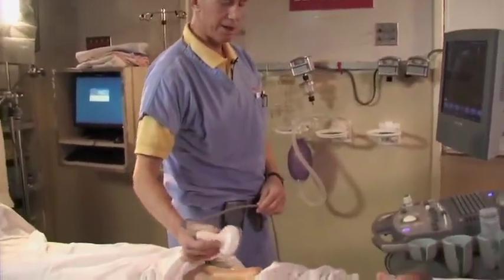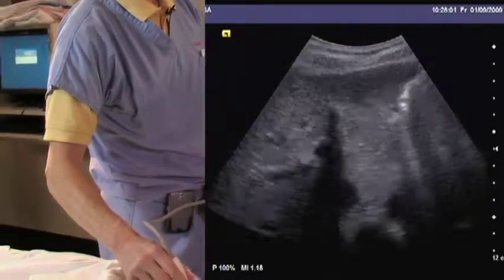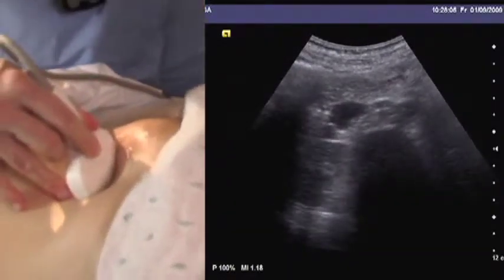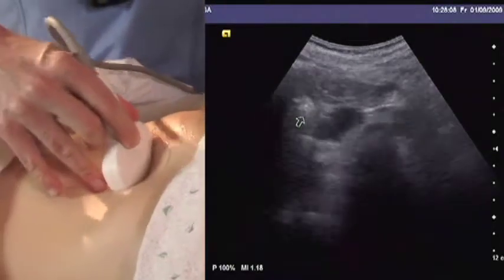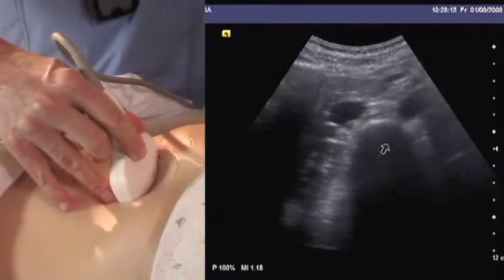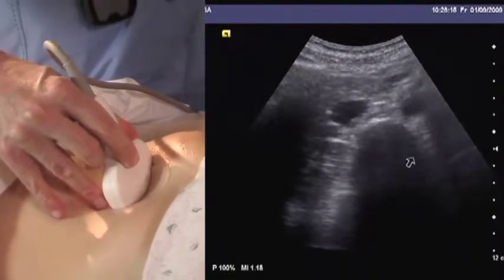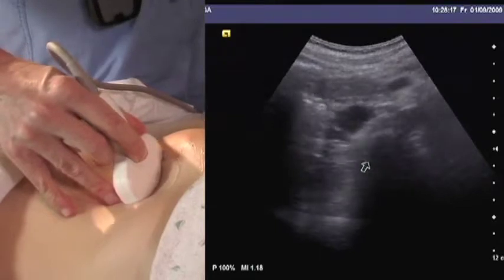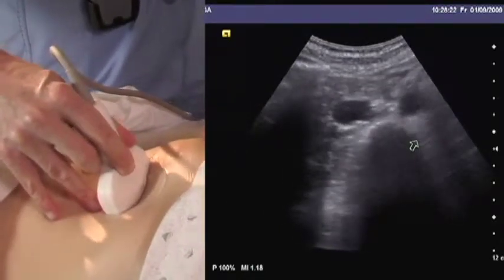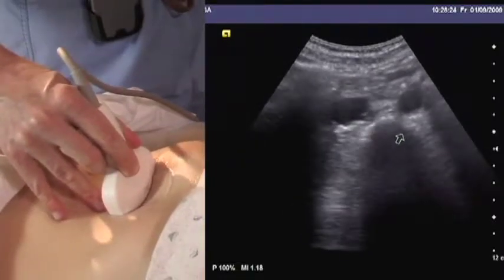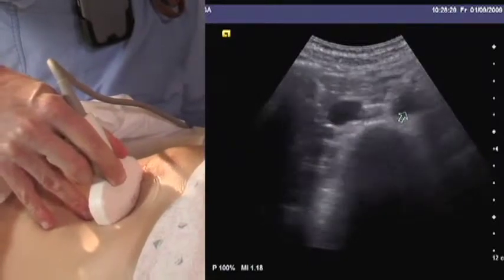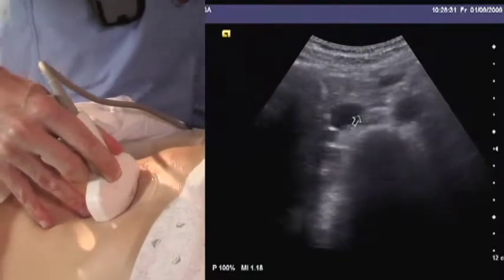By way of review, we usually start in the transverse plane. The first thing we need to do is identify the vertebral body, seen here as an inverted U-shape with characteristic posterior acoustic shadowing. Once found, it's a useful landmark because it enables us to identify the two big vessels on either side of it: anteriorly, on the patient's left, the aorta, and on the patient's right, the IVC.